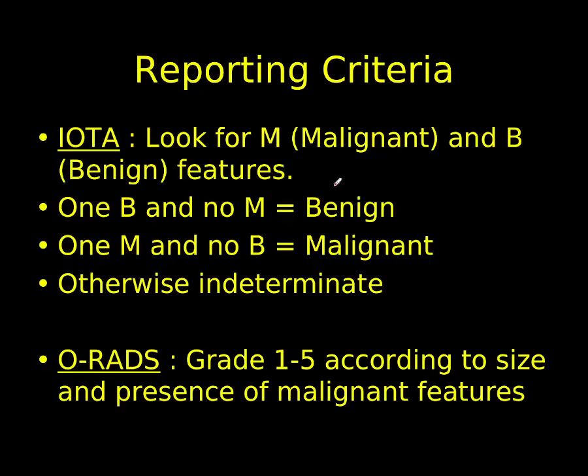So that was just a quick run through primary ovarian malignancies and a few words there on metastases as well. But of course they're not easy to identify. We've mentioned large size, irregular margin, colour flow, those sort of things. But what we do need is a criteria which we can use to grade in order to categorize tumours into benign or malignant, something that's rather reproducible. And we have two systems with which we can do that.